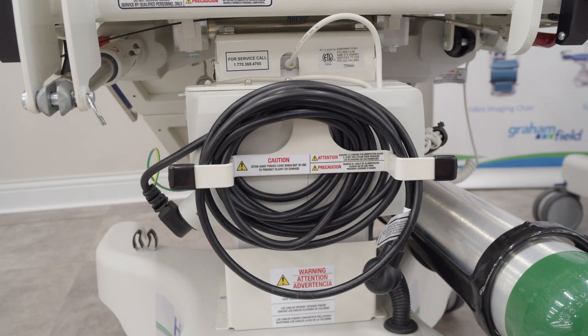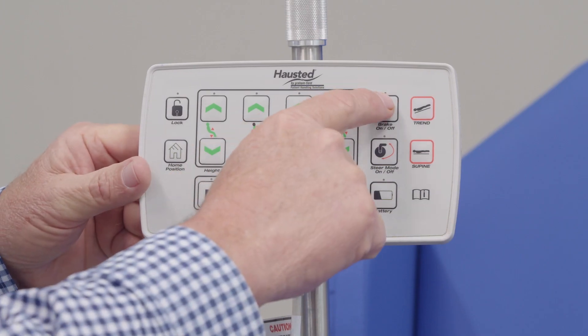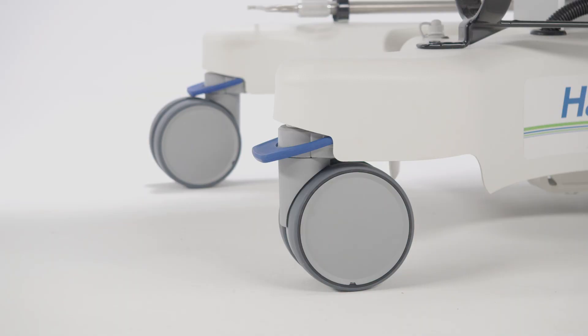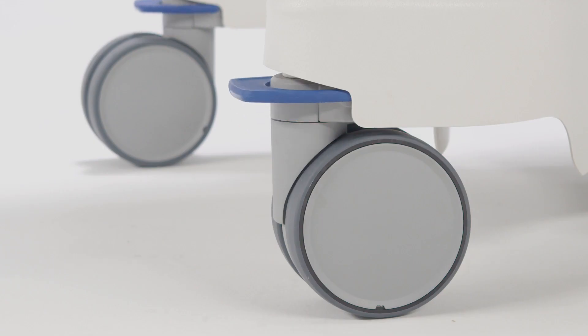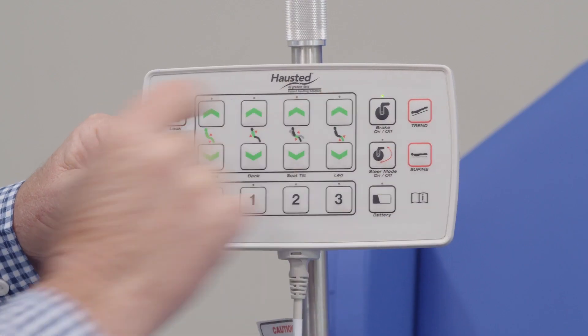A reminder: the chair cannot be moved until the column controller, or the pendant and smart caster controller in the base of the unit, has received the signal from the pendant. An easy indicator of this is the movement of the blue tabs, which will take about one second. Once you see the movement, then any action can be selected from the pendant.